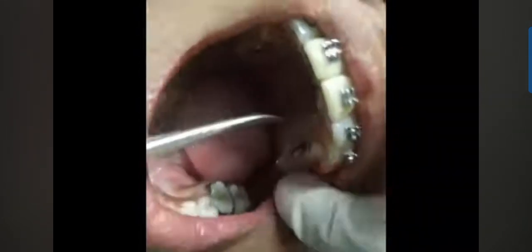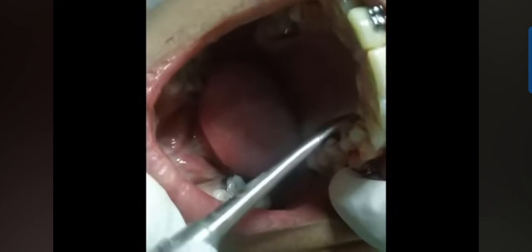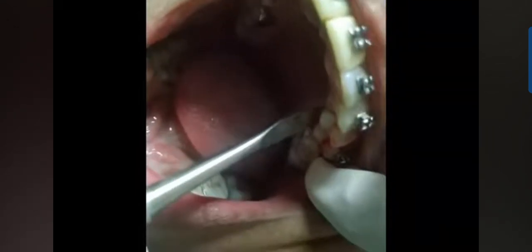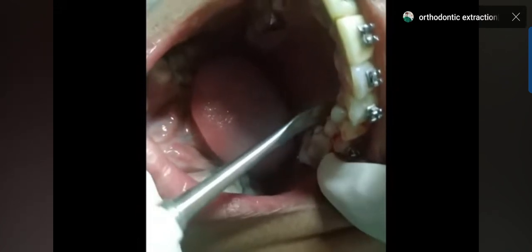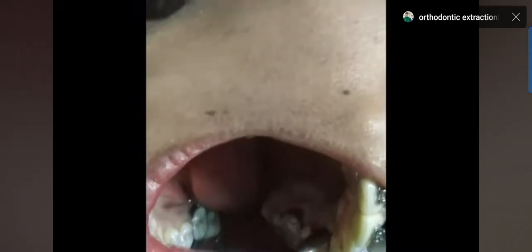Same thing is to be done in the palatal region. Go from mesial to labial region and from labial to distal region, and then we will also expose the palatal root for inserting the premolar forceps easily, so that the premolar forceps is accessible and visible and it does not lacerate the gingiva.